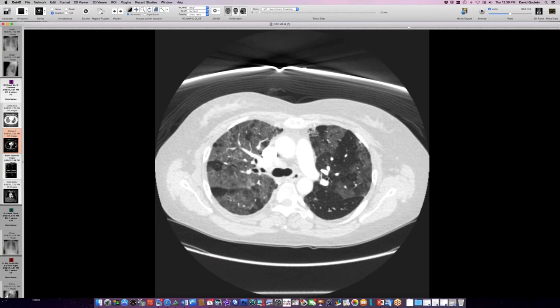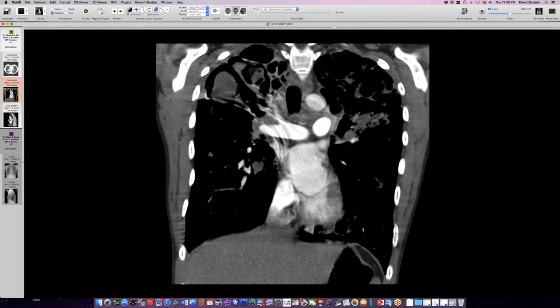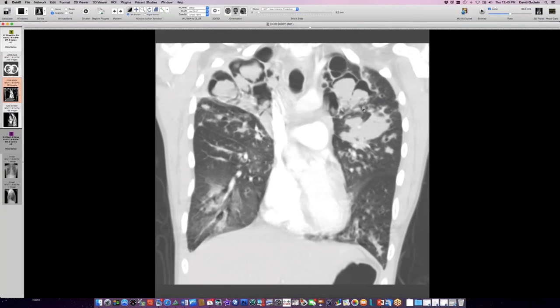Okay. Very. And then this is a woman with cystic fibrosis, and she's got a lot of scarring in her apices, a lot of bronchial disease, some big cavities in her apex, probably derived from bronchi, and then there are these occupants in these cavities here. So she's got mycetomas sitting in her apical cavities, and let me show you on CT scan these big mycetomas here in these large apical cavities on both sides.